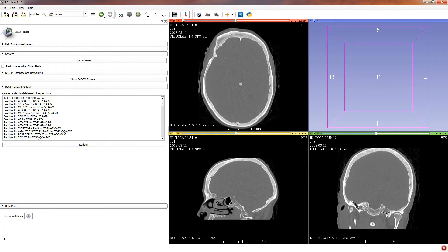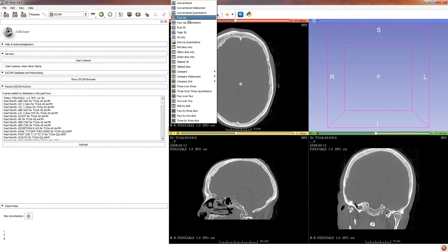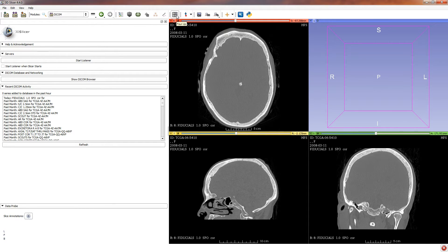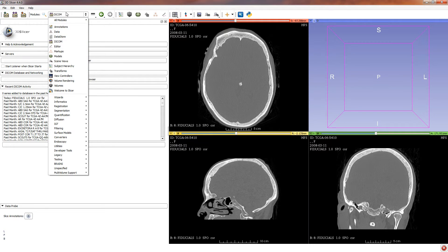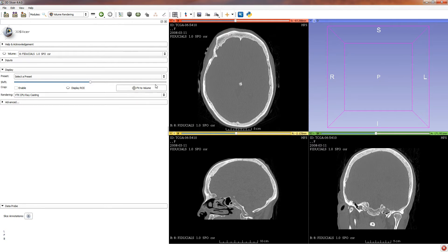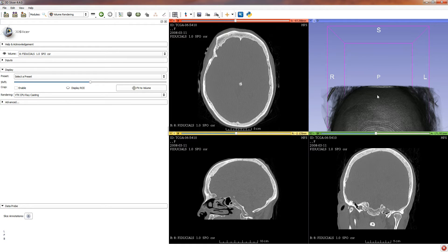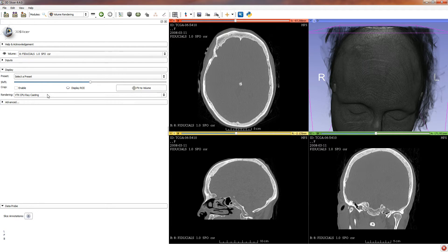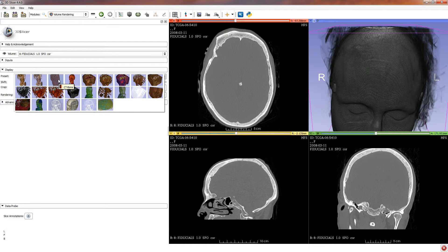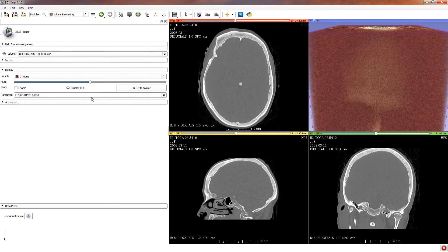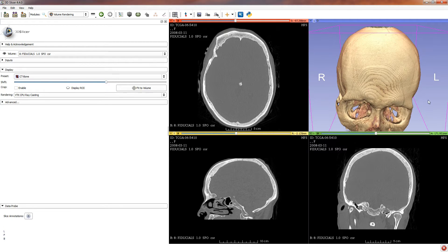You'll see that we have our skull CT scan loaded into Slicer. You should have this viewport. If you don't, select the 4-up viewport configuration from the menu setting. From the basic 4-up view, go to volume rendering from the modules dropdown menu and select volume rendering. There's a little eyeball next to volume — turn that on to enable the 3D rendering. You'll notice the 3D render is not centered; click the crosshair to center the object on the scene. Now our CT skull is centered. Select a preset — I like the third preset, CT bone.